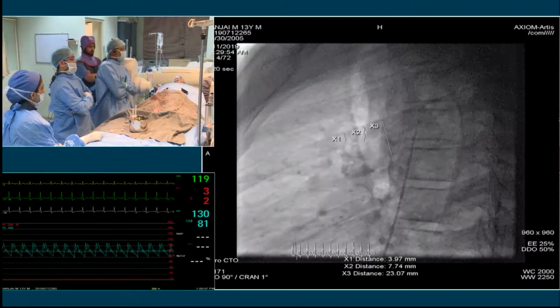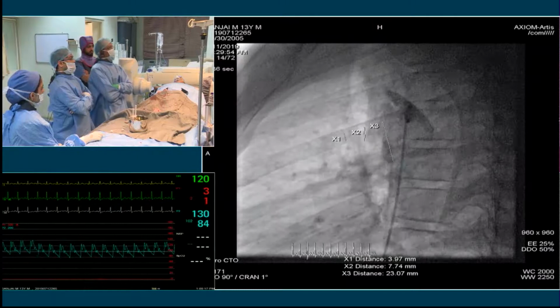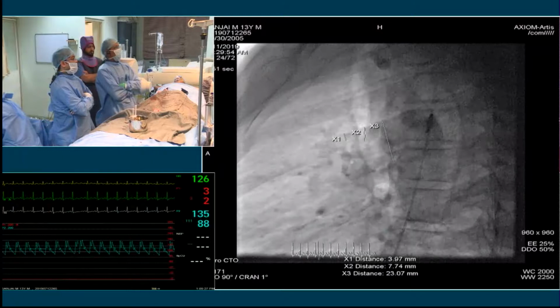No, no, but for the land, as I said, as Dr. Krishnamurthy said, for the purpose of deploying it, we need a landmark. Since it is an angiogram-based device closure, not the echocardiogram-based device closure, I thought at least a landmark is enough because I already saw the echo, which is enough for choosing the size of the device.